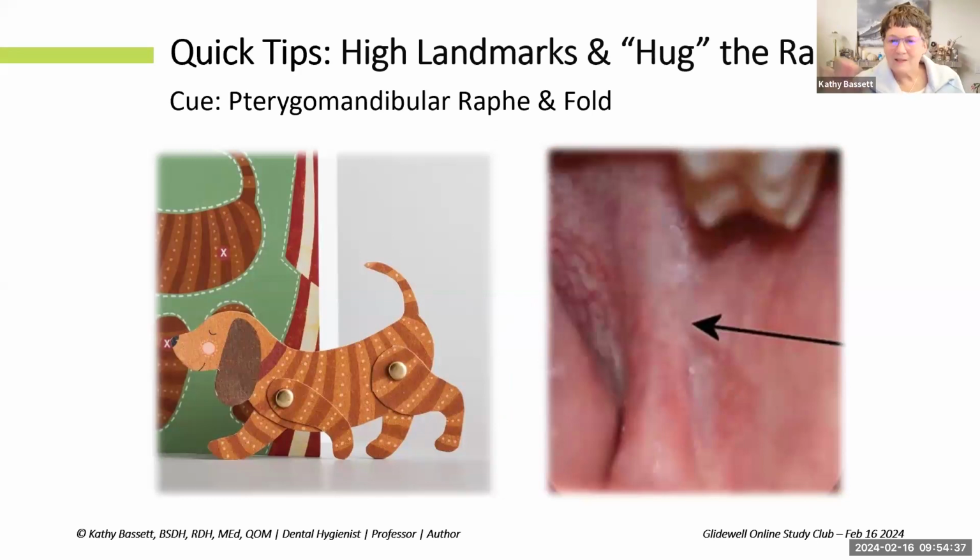And so this next week, I just challenge you with every patient you see, just on glance alone, see if you can find this target, even without picking up a cotton swab. And so we're talking about this curve, common to the hind leg of a dog, and you have this bend. And what you see is this part comes down off the soft palate till this junction, and then there's an obvious little bend at that dog leg. And so if I don't even pick up a cotton swab, I'll just visualize for the dog leg junction and I'll go there. Or I can palpate to that deepest area and go there.